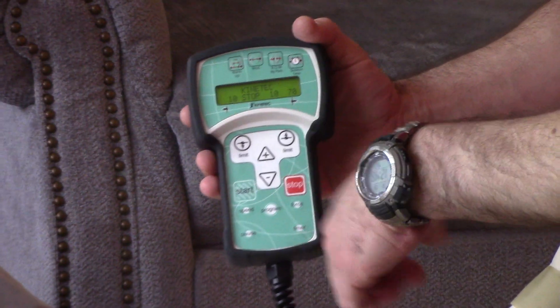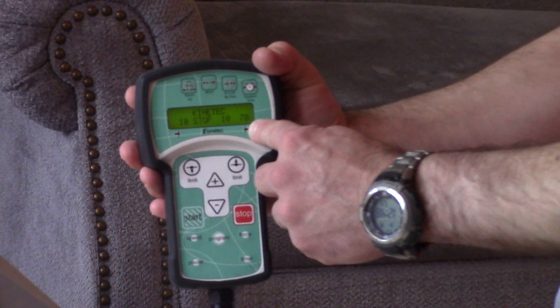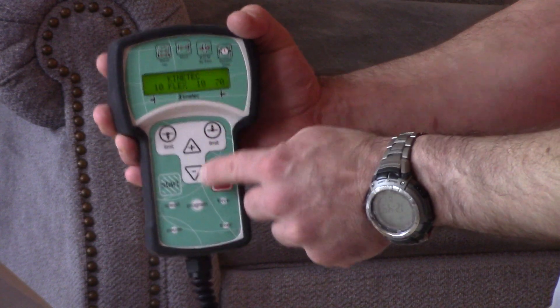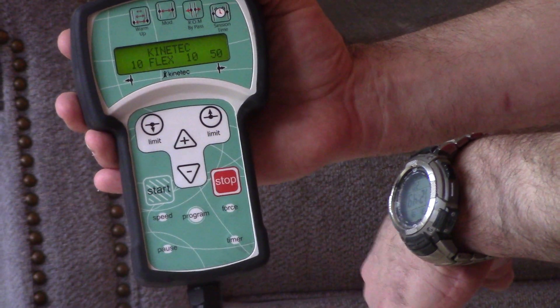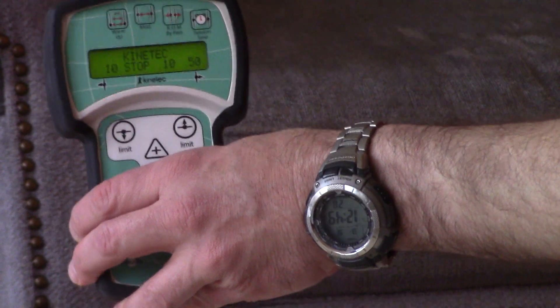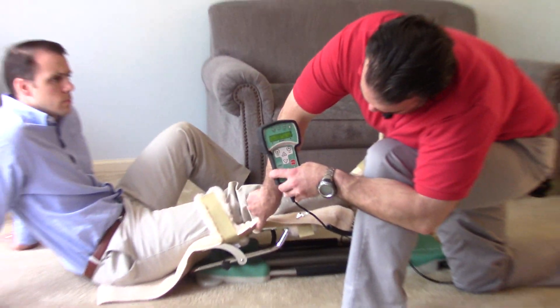Right now, the 70 is where the flexion is currently set — flexion is the bending of your knee, the bend upward. 70 is pretty aggressive, so we're going to bring that down. We'll tap this arrow pointing at the 70, then use the plus and minus arrows to bring it down to 50. It'll blink a couple times, then stay steady when it's set. The 10 is the extension, which is the straightening out of your leg — it's fully extended to 10 right now. That's a pretty good number to start with. That degree is measured along the fulcrum where the machine bends.